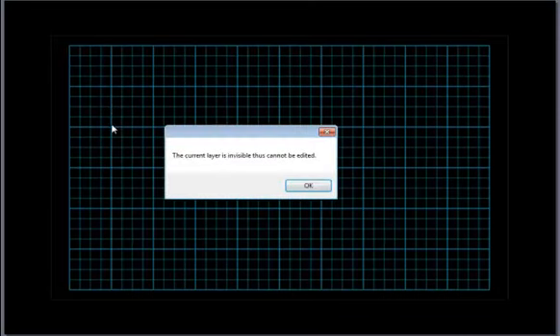Now, again, let's draw a normal ECG. So we'll start up here. Okay. It is invisible. I know it's invisible and can't be edited. I'm trying to make it visible. Here we go. I made it visible.